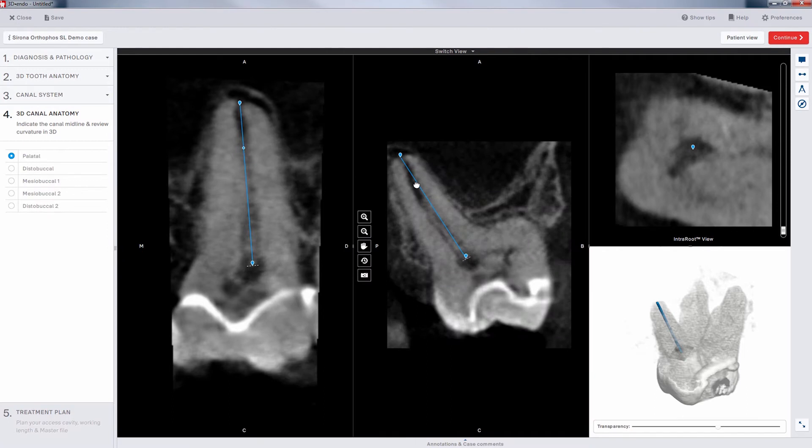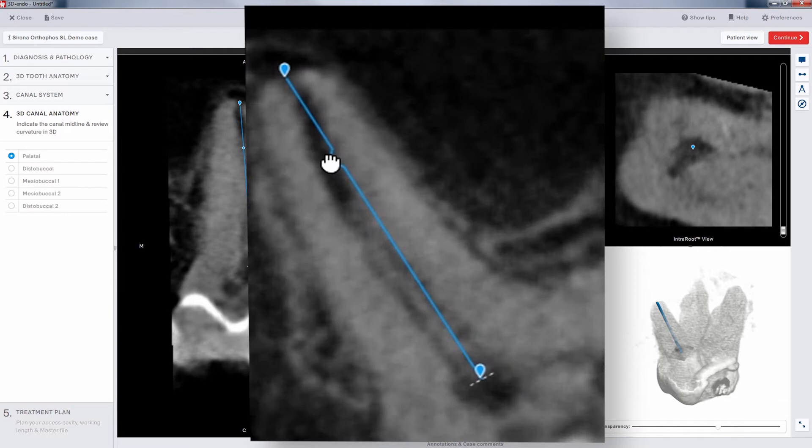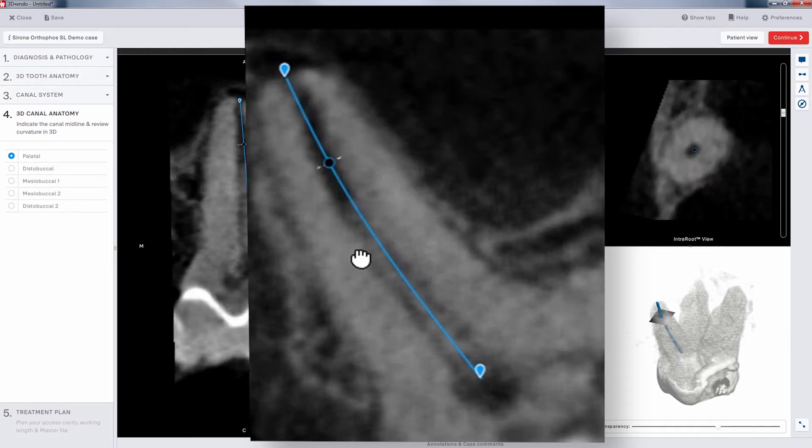Initially, the software creates a line between the two points. Click and hold to select a point on the line to adjust. Drag that point over to center it in the canal. When you release it, the line will adjust to the canal.